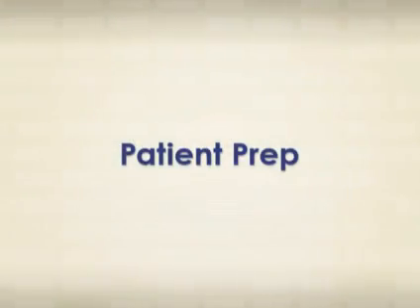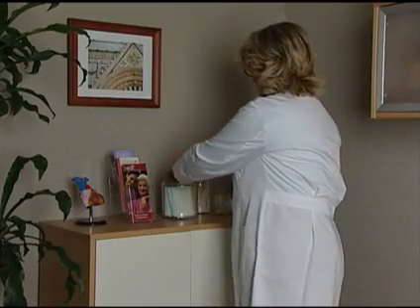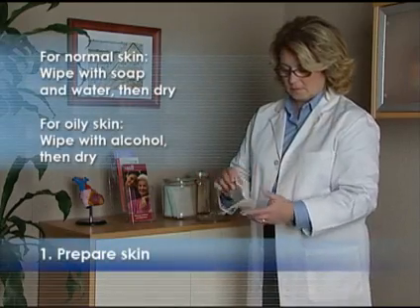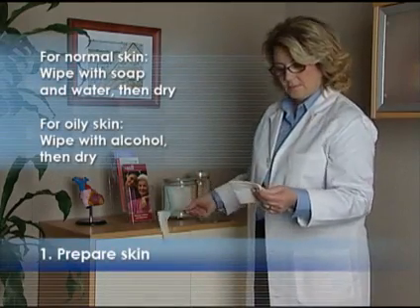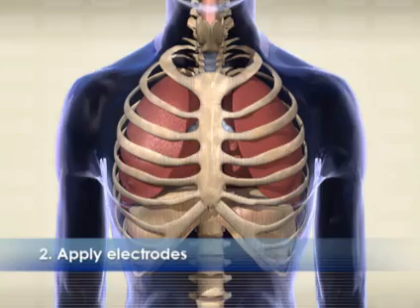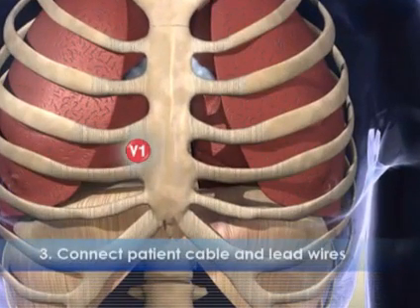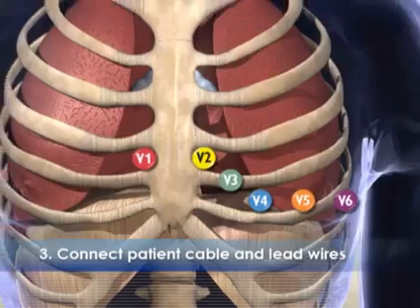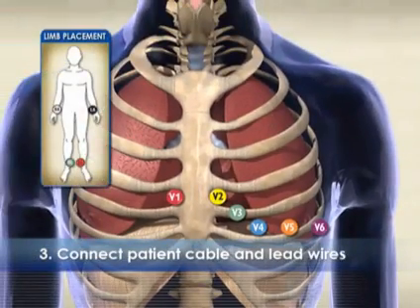Let's move on to patient prep, which is the key to an accurate ECG reading. The first step is to prepare the patient's skin. You may need to shave the electrode site before cleaning if excessive hair is present. Apply the electrodes and connect the lead wires before entering the patient's information. This allows time for the electrodes to adhere and improves conductivity.